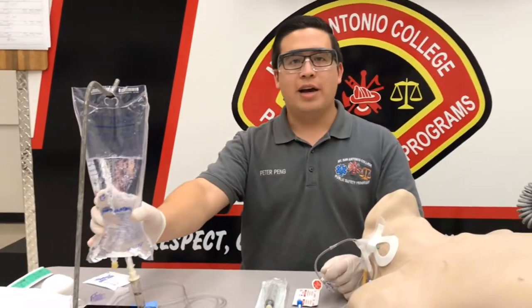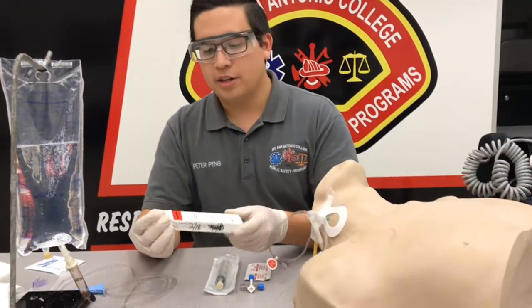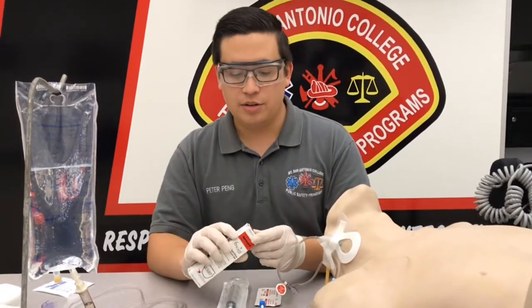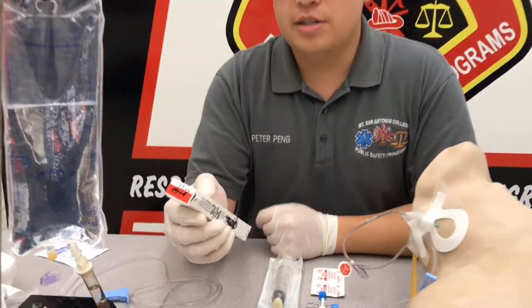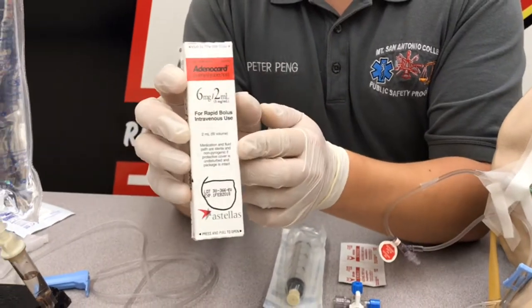Our normal saline bag has already been spiked and primed. I'll go ahead and prep our adenosine, and also make sure that you go through your six patient rights before giving the medication. This is adenosine — it is six milligrams in two mLs, and the dose we're going to give is six milligrams, so we're going to push this whole thing.